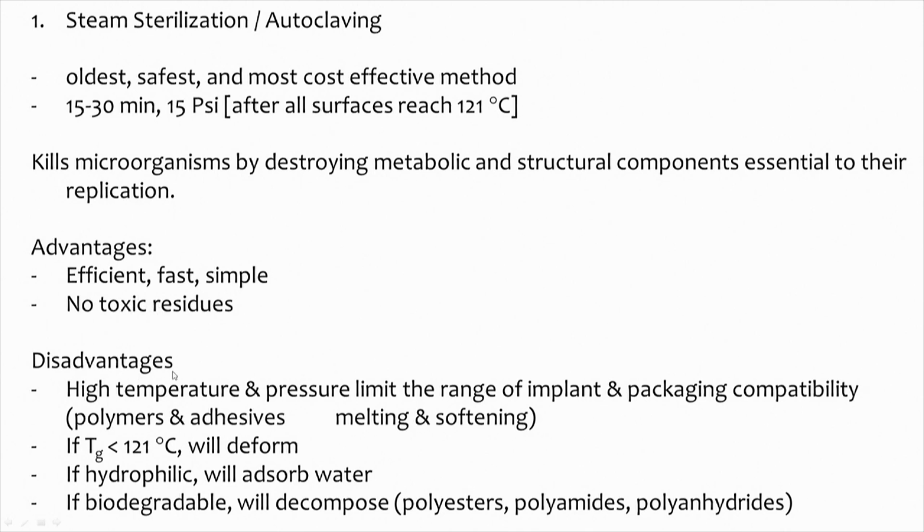Disadvantages, of course, we cannot use it for packaging material, polymers, adhesives, or materials which may melt or soften. That means if Tg is less than 121, then the material will get deformed if I raise the temperature to 121 C. If it is a hydrophilic material, it may absorb moisture. If it is a biodegradable or decomposing material like polyesters, then steam sterilization is not a good method, but it is the cheapest and it has been.